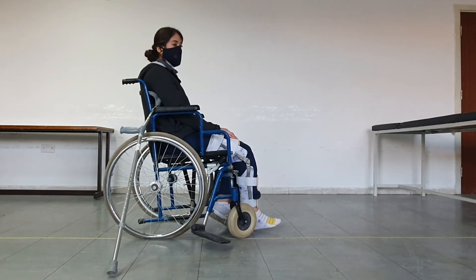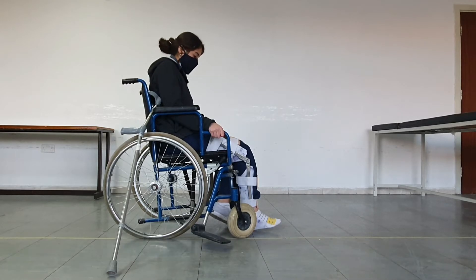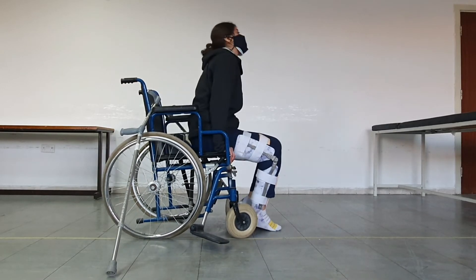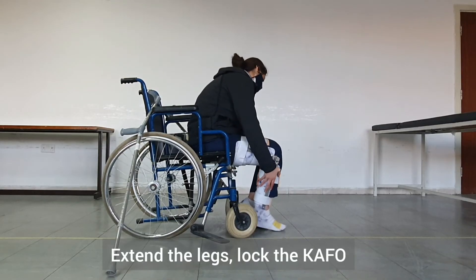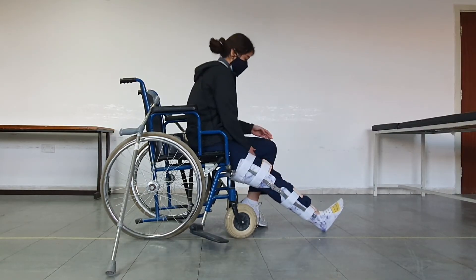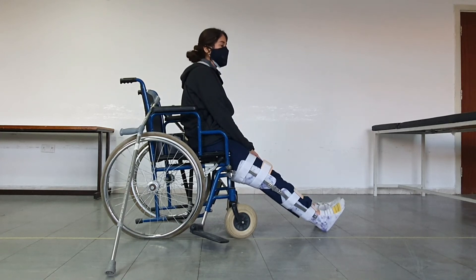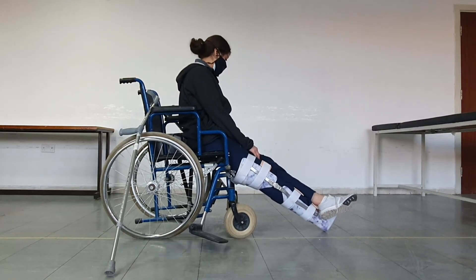Next, the patient will slide forward to the front edge of the chair by doing push-ups and sliding forward. Once at the edge, they need to extend their legs and lock the knee hinge of the orthosis — now it's locked. If the patient has two orthoses, they need to do it for both sides. Next, they need to cross the legs.